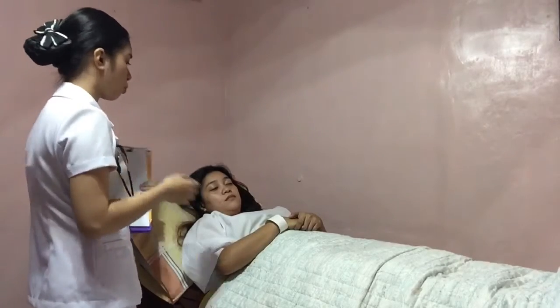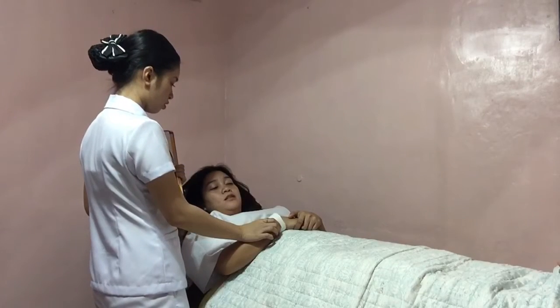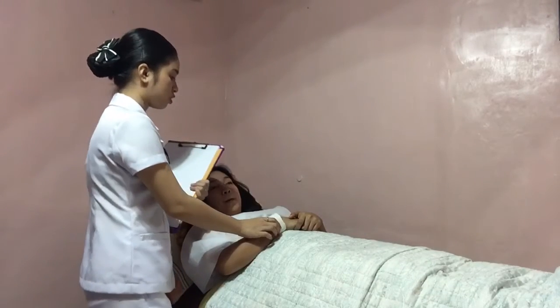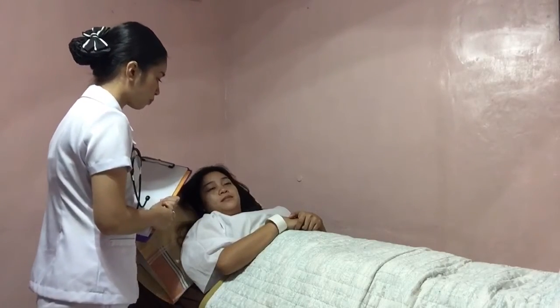Hello, ma'am. Good morning. My name is Franz, your student nurse. So, may I know your name and your birthday? February 16, 2002. Okay, so I'm going to take your blood pressure. So is that okay with you? Yes, ma'am. So now position the client appropriately.